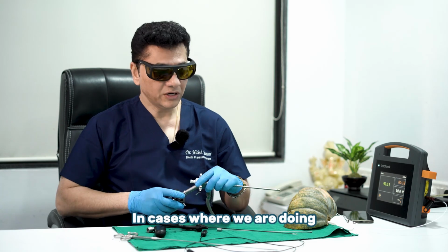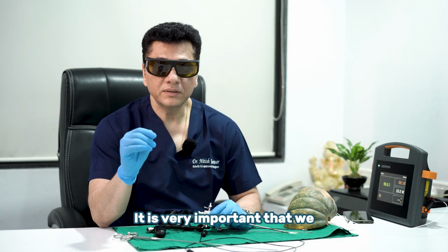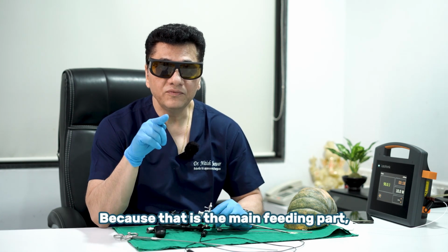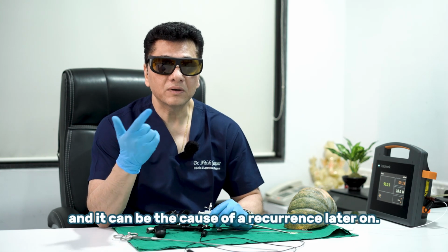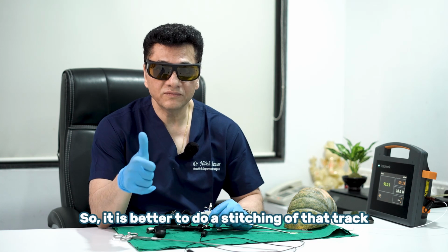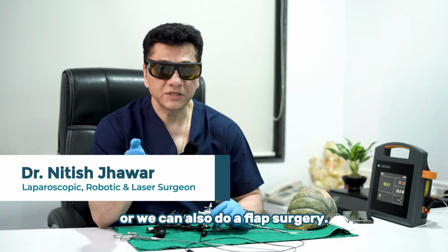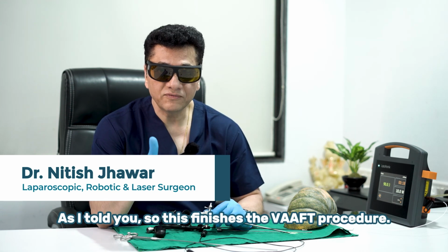In cases where we are doing a sphincter saving procedure, it is very important that we close the internal opening because that is the main feeding part which is causing the fistula, and it can be the cause of a recurrence later on. So it is better to do a stitching of that tract, or we can also do a flap surgery as I told you. So this finishes the VAAFT procedure.